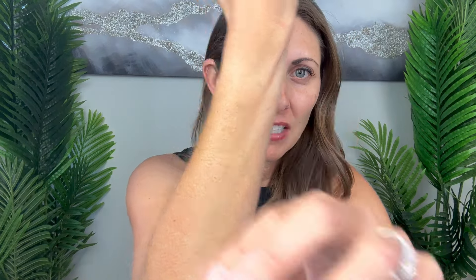Again, I have arm hair - this isn't hurting one bit. Let's see how dry everything is. Remember I did wet it earlier - it seems to be totally dry.